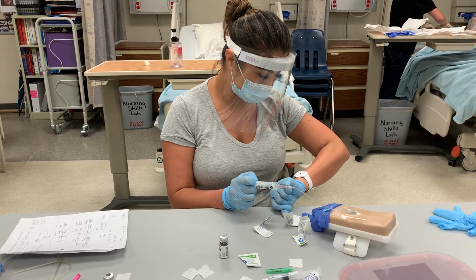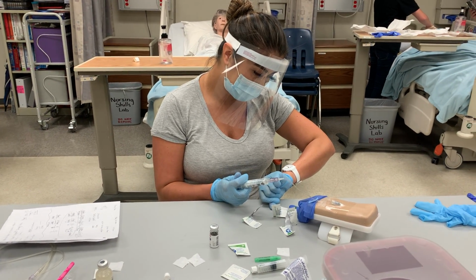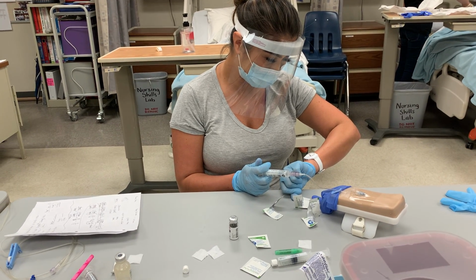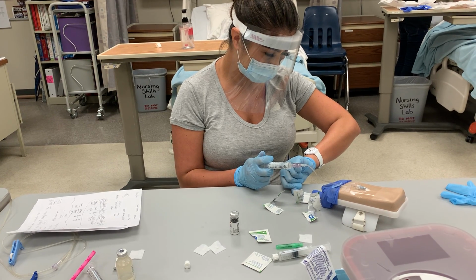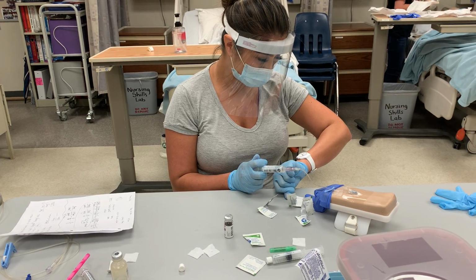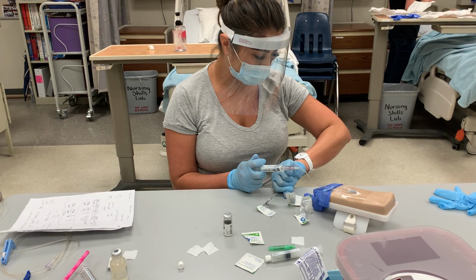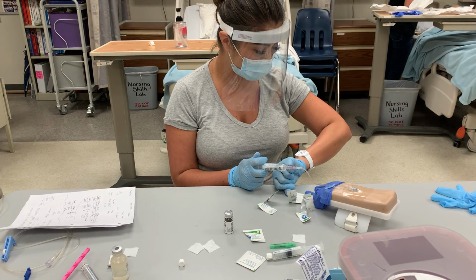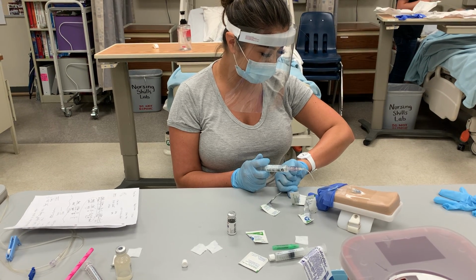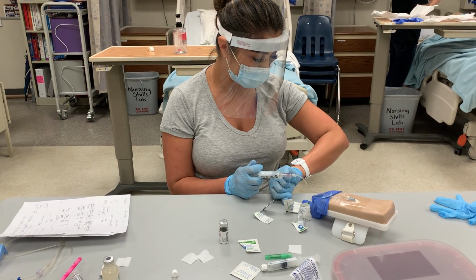I'm going to introduce myself: hello, my name is Andre. Identify yourself, provide privacy, check allergies. How are you feeling, Mr. Smith? Good. You have to push this slowly just so that you don't have any reactions to the medication and we know that it's safe.